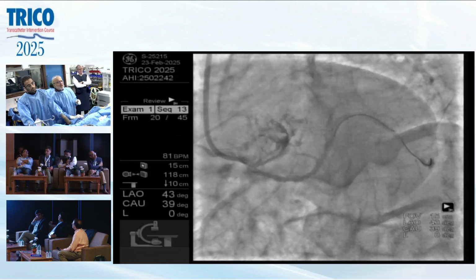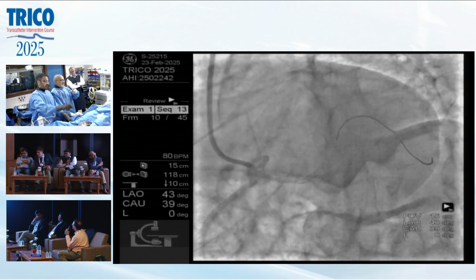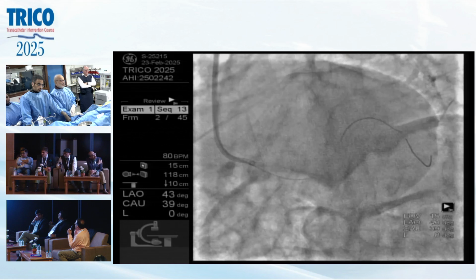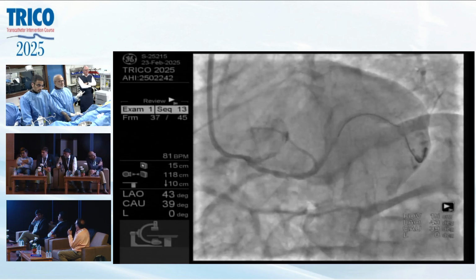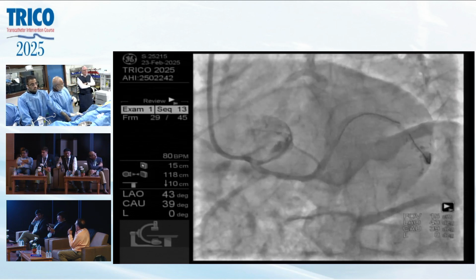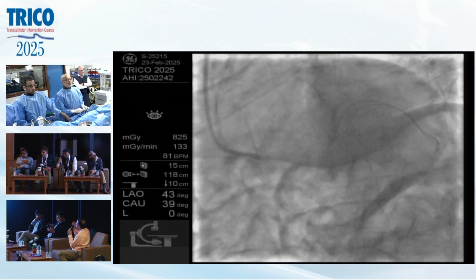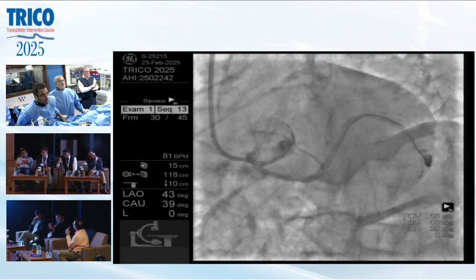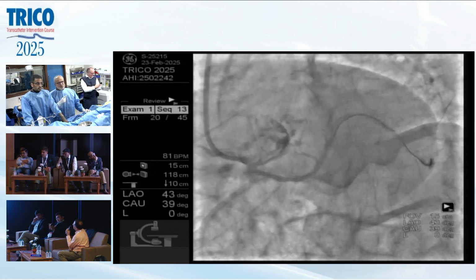So distal part, how distal do we have to go? It looks like there is ectasia in between, and then there is some segment which few people may interpret as disease, few may interpret as regular. So what to do? I think I would stop. There's a tiny branch distally also. I would stop right after that branch. Distally, and there's a vertical branch. Which branch? Just show me the previous view. There is a very tiny branch that fills right there. Yeah, I would stop right after that and come proximal back till the proximal branch.